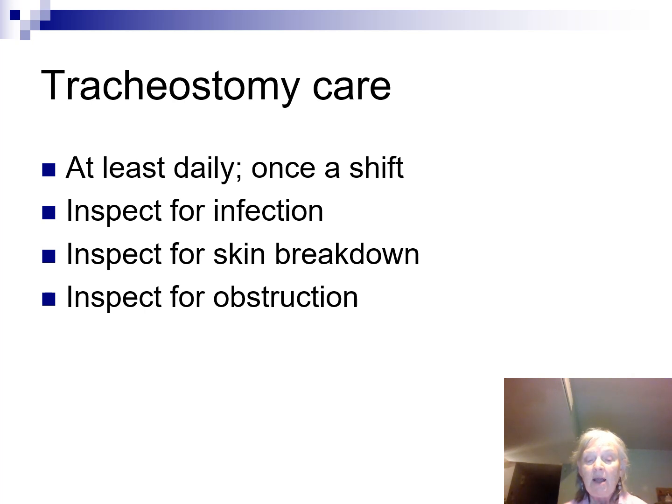When they did, they were able to see like a little covering on the end of the inner cannula. What had happened was there were some thin secretions on the inside of the outer cannula, and whenever they put the inner cannula back in, it was picking up those secretions and was acting like a piece of film over the bottom of the inner cannula.